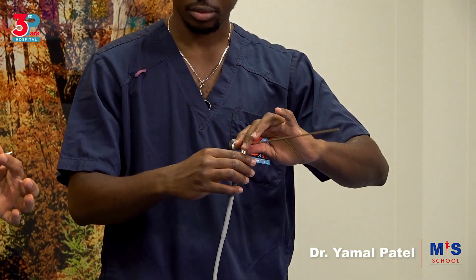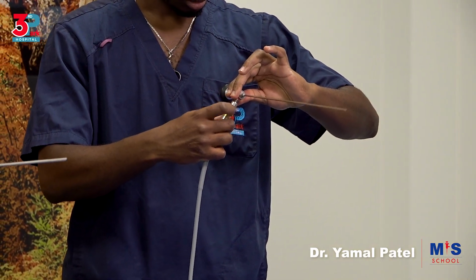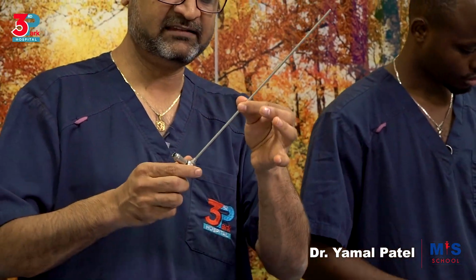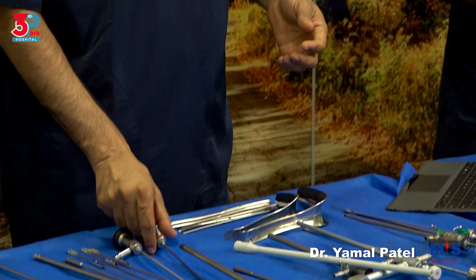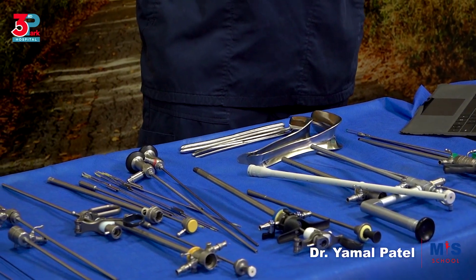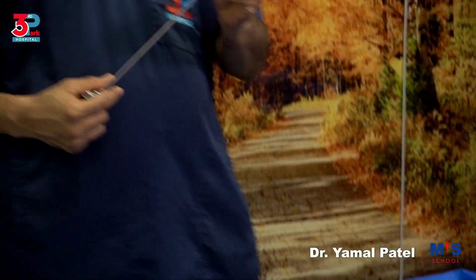And these are defined or described based on diameter. So these are diameter of the barrel. This is a 4 millimeter scope for hysteroscopy. This is a 2.9 millimeter scope. And then we also have a 1.9 or a 2 millimeter scope for the office hysteroscope, which is the mini hysteroscope.